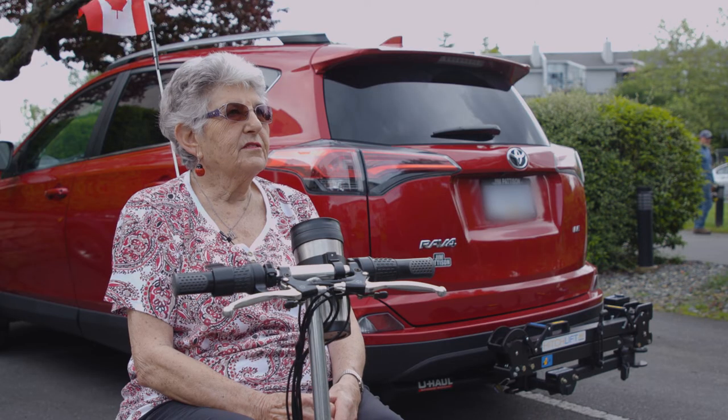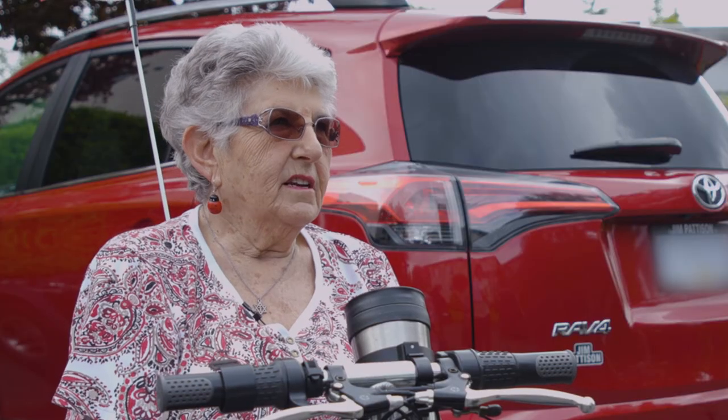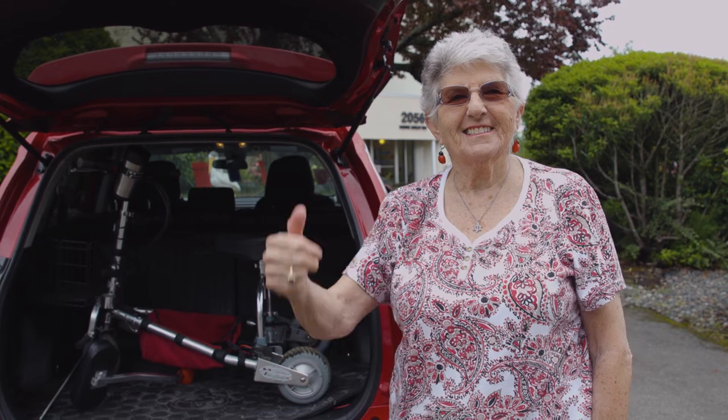With the Hitch Lift, I'm more confident about driving further distances. I can be more independent. I don't have to rely on friends and neighbors. I get out more, really.